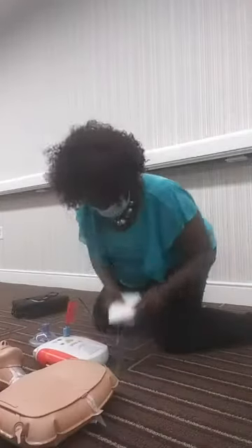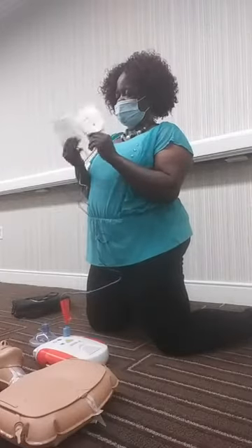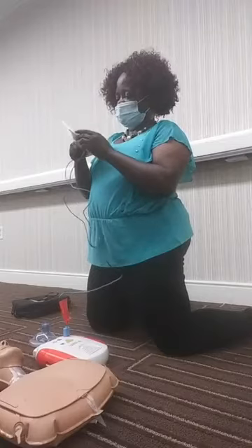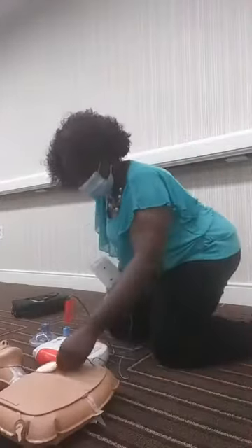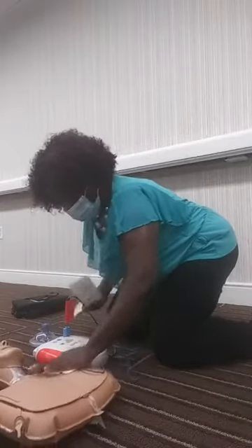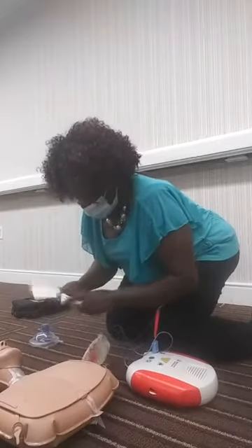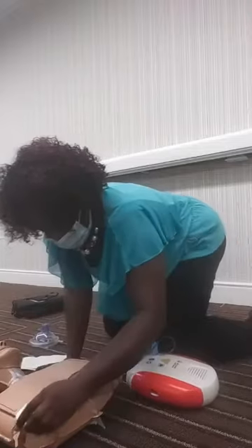Put the pads in. On the pads, it will show you where to place them. These are adult, infant, and child pads all in one. With adults and children, this one goes at the top right just under the collarbone, and this one goes on the bottom left just below the rib cage.